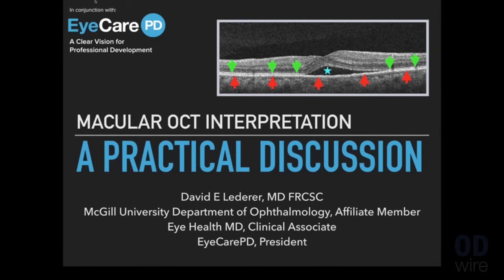I think that this additional lecture that we've got on tap, Macular OCT Interpretation, a Practical Discussion, should provide some real nice pearls and practical applications that you can use immediately in your clinics right after the lecture. So let's get started.